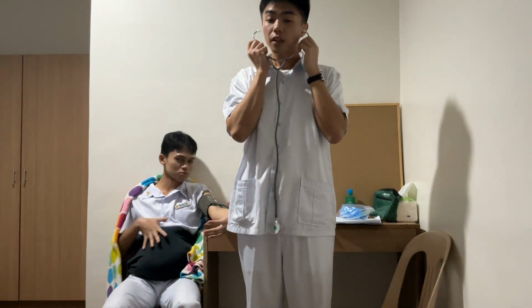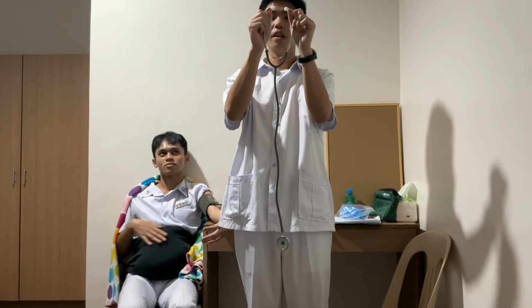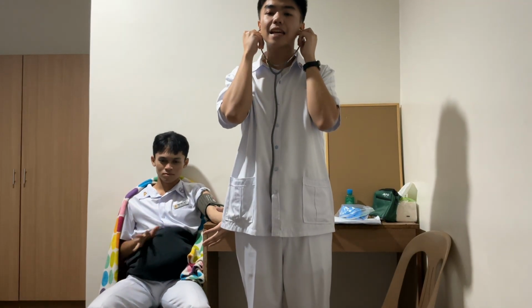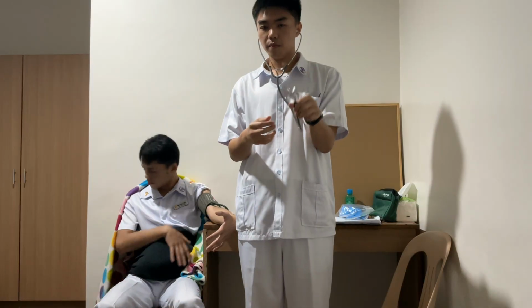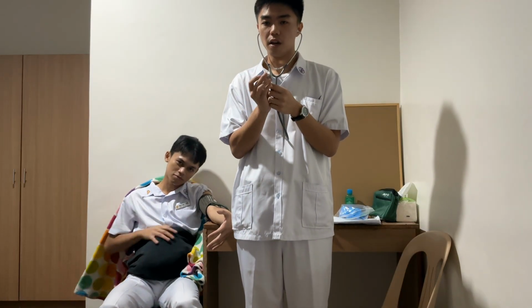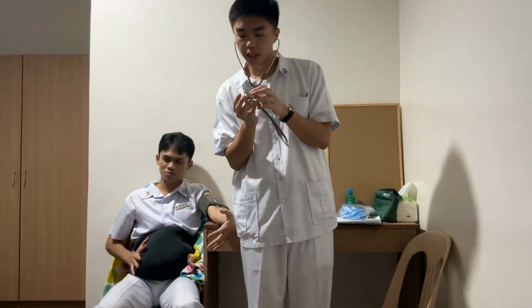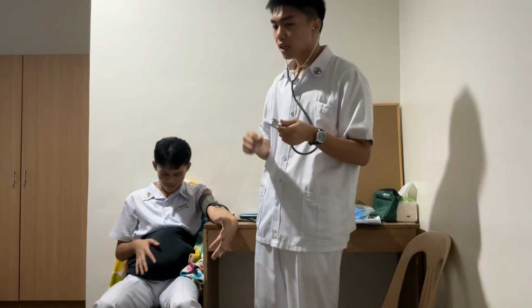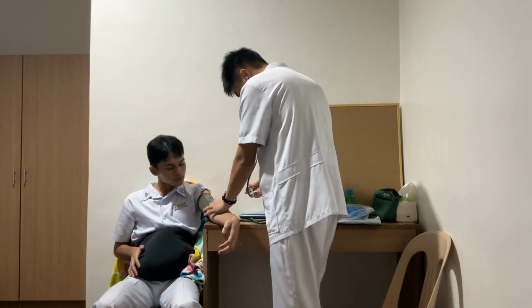Then I'm going to insert it to my ear, and then push it in such a position that it follows the opening of my ear. That is why we have to push it forward. Then it is tilted slightly forward. Then ensure that the stethoscope hangs freely from the ears to the diaphragm. Nothing in between them. Okay, so we hear optimal sound of the heart. So checking now if I can hear it, and true enough, I can hear it. So I'm going to place the stethoscope directly on the skin, not with anything in between it. So again, double check.